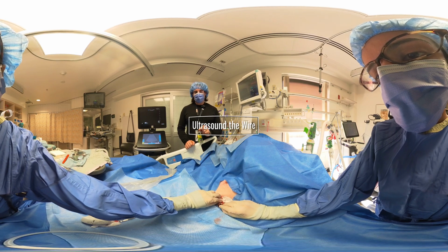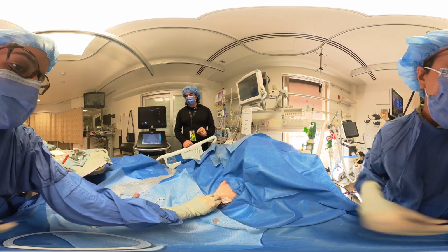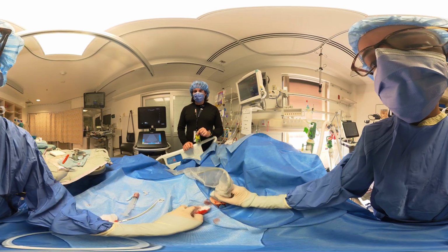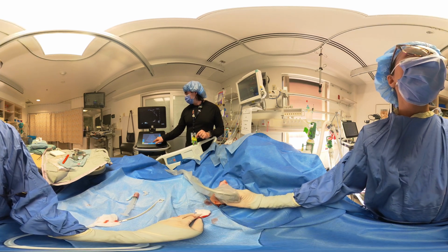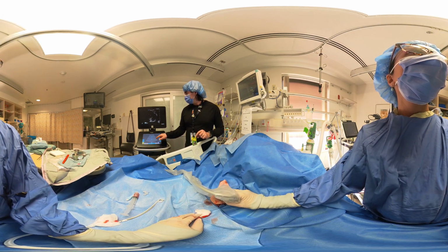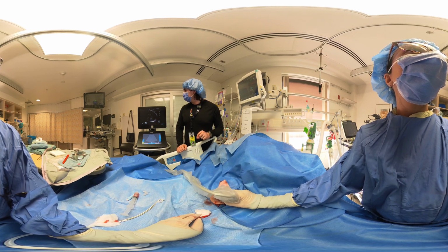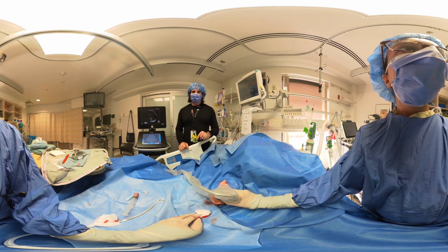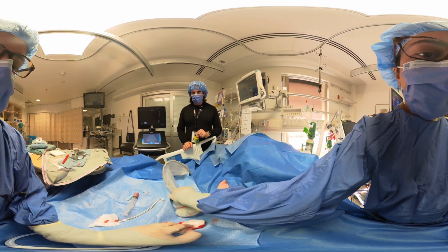Now we're going to ultrasound the wire to make sure it's in good position. So let's get the curvilinear probe again and make sure we're happy with the wire position. This is just especially if you're uncertain of the location. Okay, so we'll just move the probe here. Yeah, there's the wire there. Okay, we can see it pass down. Again, if you're happy and you've aspirated pleural fluid, this step may be unnecessary, especially if you have a nice, good location, but it doesn't hurt.